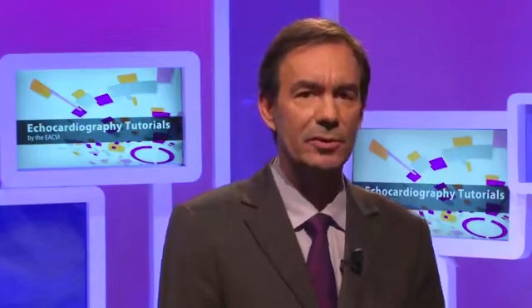Raluca Drvu will show us how to assess patients with mitral stenosis. She will go through the specific findings that we have to look for at the level of the mitral valve. Then she will move to how to assess the severity using the various methods available. She will also address the limitations of this method.